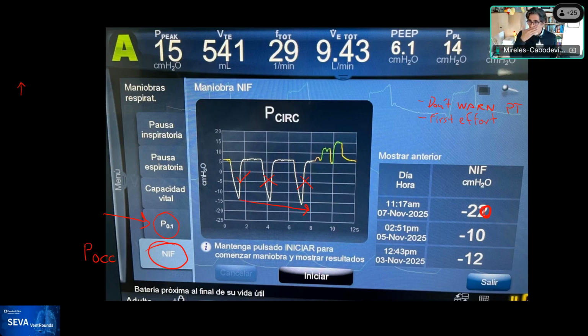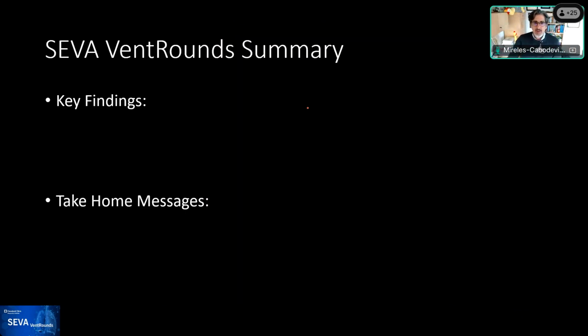I'm going to give you a couple of scenarios, and perhaps this will be instructional for the team, because these numbers may be completely normal and you will ignore them. We have ignored them for decades. I'm not saying that's normal, but it's important to know the potential causes for them. I'm not saying that this is the case on this one. So I'm going to go to the next screen so that we have space, and I'm going to draw a little graph for you, and then you can guide us through that.